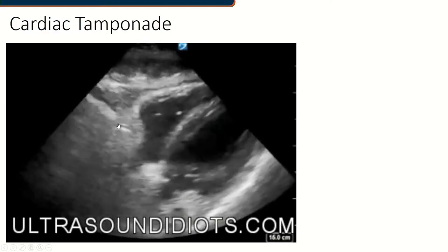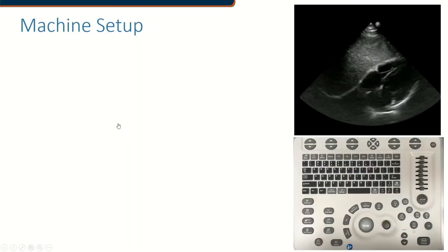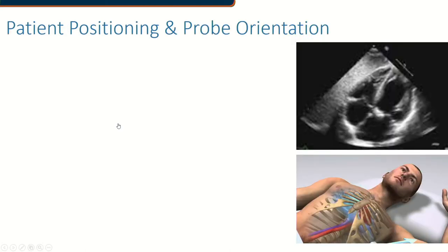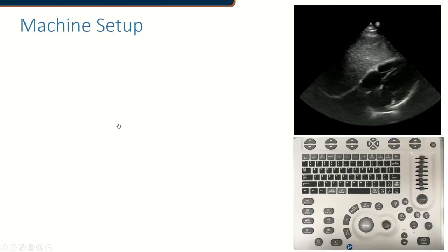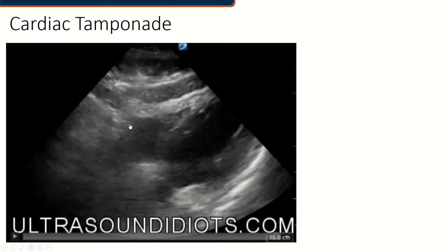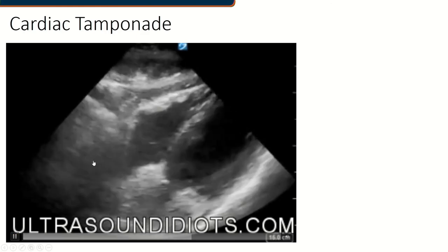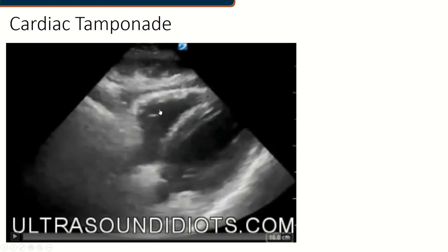Here's one from Ultrasound Idiots, another website available for people at EVMS run by one of our ER faculty. That one shows somebody in tamponade. You'll see the trampolining start to occur over the wall of the right ventricle as this person is heading into tamponade.